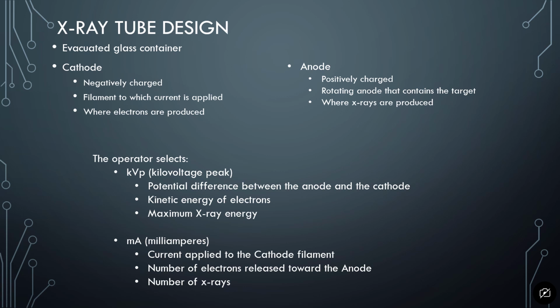Now, if you had a really heavy patient and there was a lot of attenuation, it may benefit to have higher MAs. One thing that newer scanners do is they have a modulation on them that will automatically change the MAS setting and increase it where there's more attenuation or density in the tissue. And that helps to get the best of both worlds, where you're increasing the MAS and optimizing your spatial resolution, but you're not giving the patient any more radiation than absolutely necessary.